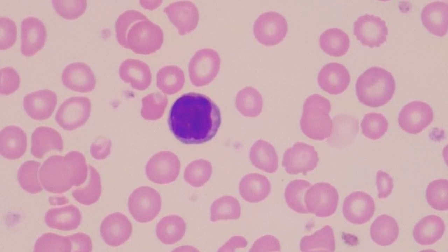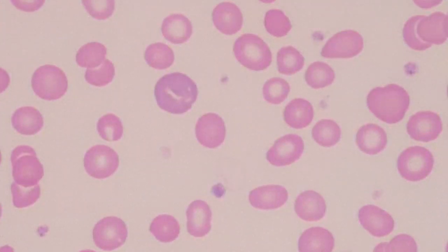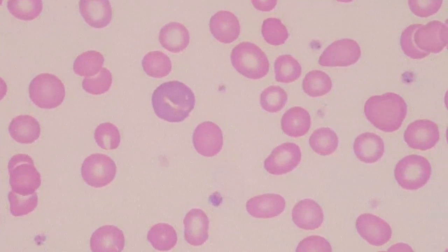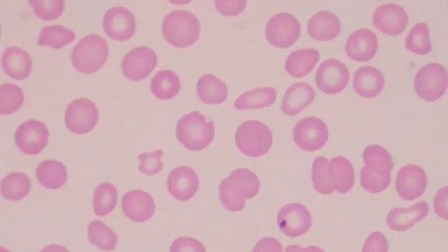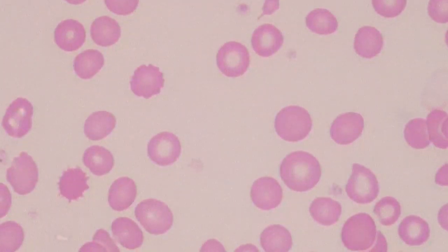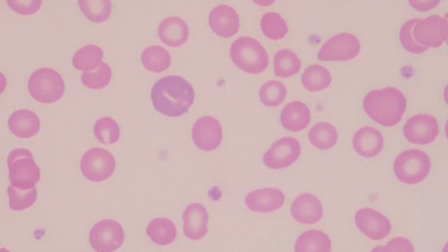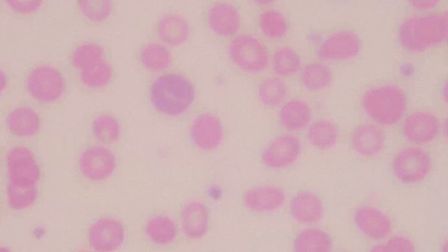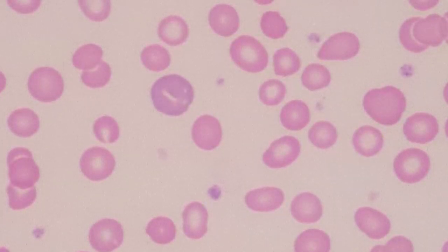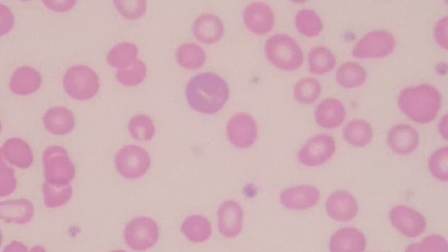Now, something that we'll move around here a little bit because there is something else I want you to see. Okay, so in the center we have indicators of anisocytosis, and what that means is that we have variation in the size of the red cells.